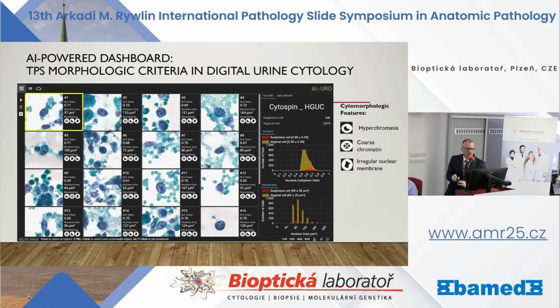I couldn't measure if it's an NC ratio of 0.5 or 0.6, because for my eye, I think I can decide, but I wouldn't bet my hand on it, not even head. You have the nuclear area, which is very nice for me.